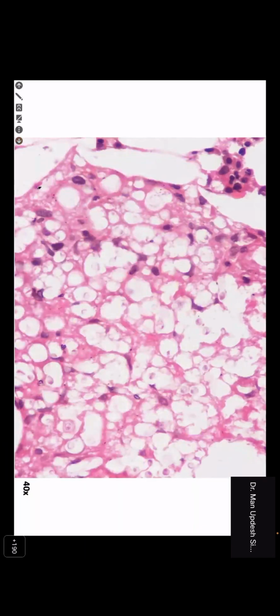Right. So at higher power, anything else we appreciate in this collection of histiocytes? I'll point out something there. It's not looking like an epithelioid granuloma, it's looking like large vacuolated histiocytes. You see some scattered nuclei there, but mostly it's all cytoplasm, very expanded and vacuolated. So something there in the vacuoles. Any comments on what it could be? Sir, is it fungus?